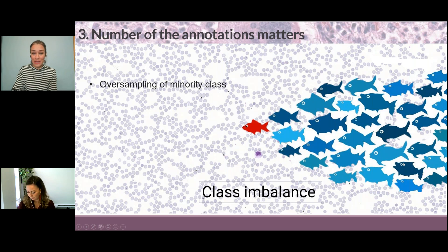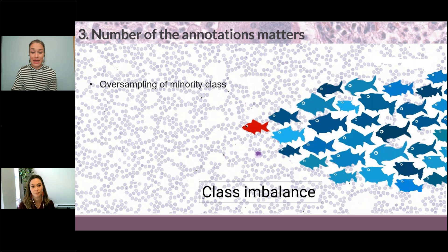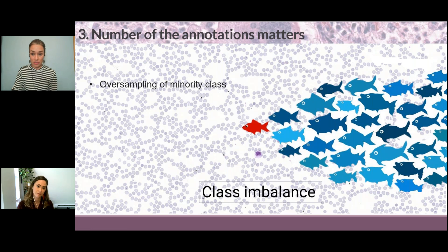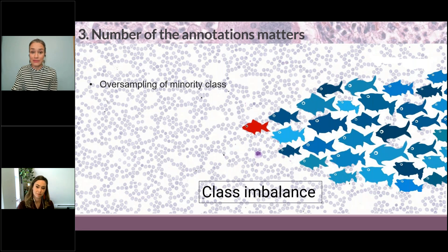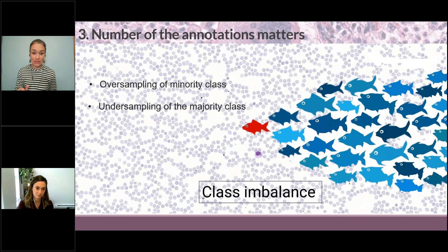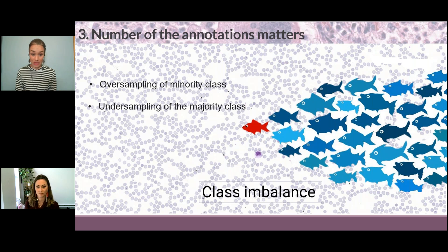One way we can take care of this is what is called oversampling of the minority class. That means I go in and find the minority class — which in the case of our example would be the infected red blood cells — and I annotate more of it than I actually see in my field of view. I go actively looking for these, and then I match the number of annotations for the minority class with the annotations of the majority class, which in this case would be the normal red blood cells.